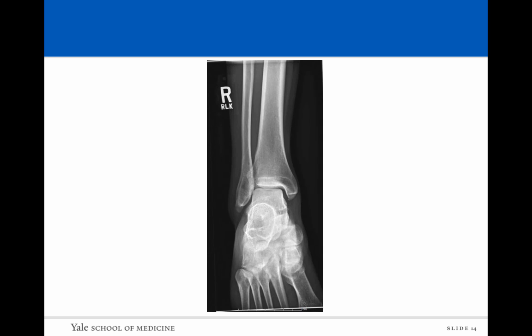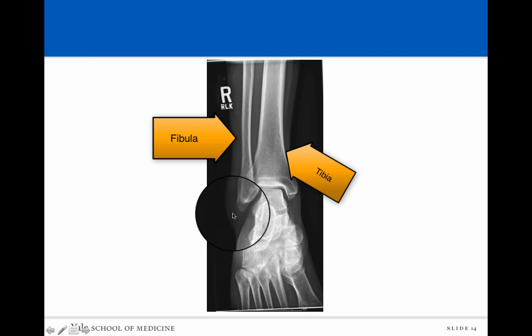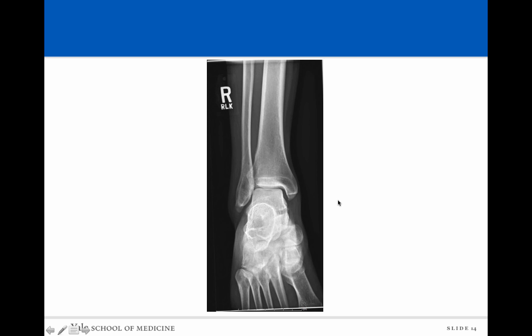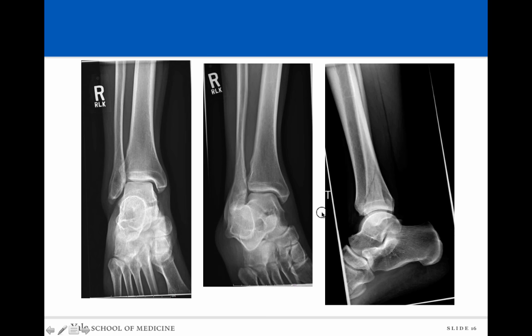Now, why do we get multiple views? Here's an X-ray of the right lower extremity ankle area in someone who fell and had pain. This is the fibula, this is the tibia — looks pretty okay, maybe subtle soft tissue thickening suggesting some injury, but everything looks intact following the contours of the bones. Taking a slightly more obliqued view, for the most part it still looks pretty good — maybe a subtle lucency here, but very hard to call that a true fracture. However, on the lateral view you can very clearly see a crack in the bone — an obliquely oriented dark line — which is a fracture, very difficult to detect on the frontal or oblique radiographic views.